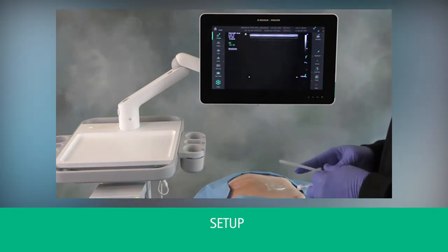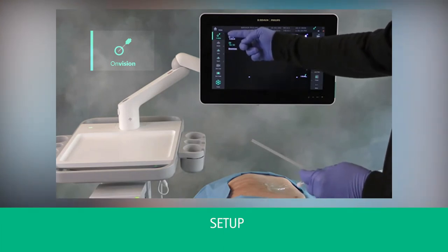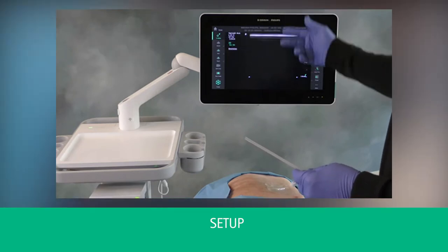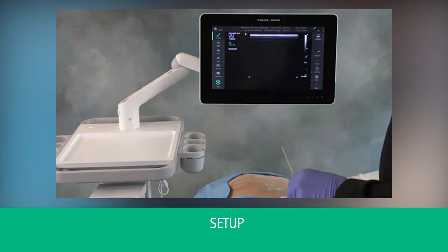Streamlining your workflow with no interruptions. You will notice that the OnVision symbol comes up simply by inserting the OnVision connector. At this point, the system is completely enabled and ready.